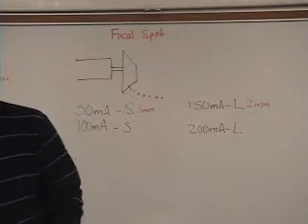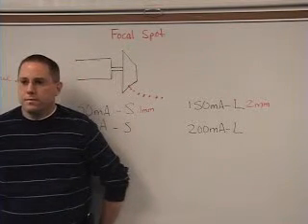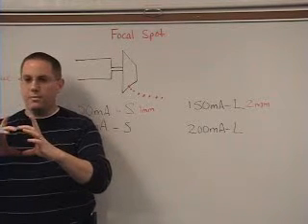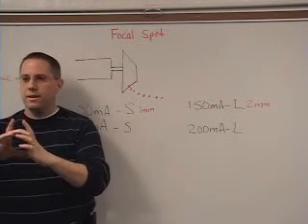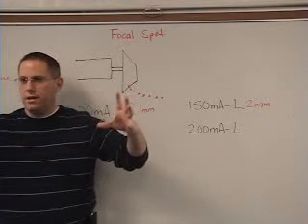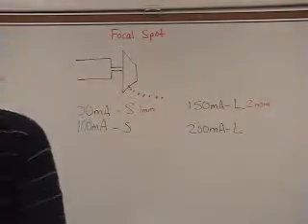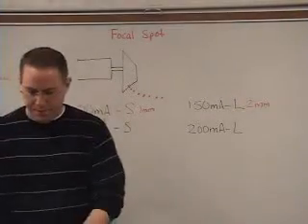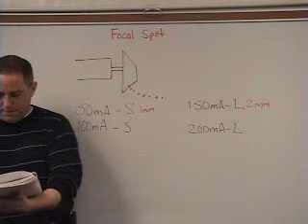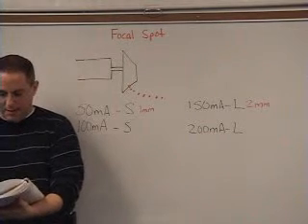What does that mean, small field size? That's your x-ray beam, the light. The smaller the light, the darker the picture is going to come out. So when you spread that light out, you're spreading out how dark or how light it's going to be. So a smaller field size is going to be a darker film. In addition, you should place the anode side of the tube over the thinner body part. So that's the anode heel effect.